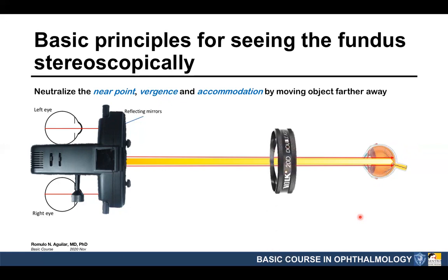So you bring in a lens, which we call a condensing lens, and finally an image is formed somewhere between the lens and the examiner. This is a favorite exam question. So remember, the image is formed somewhere between the lens and the examiner or the eyepieces. So this, again, putting it in a very simple way, is the physical optical principles of your indirect ophthalmoscopy.